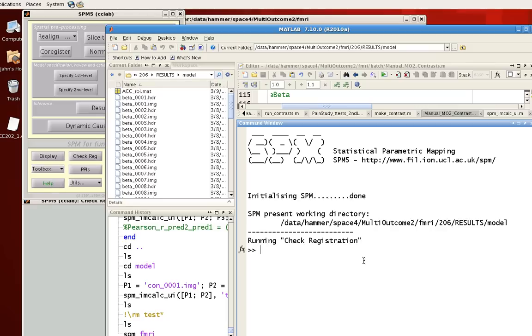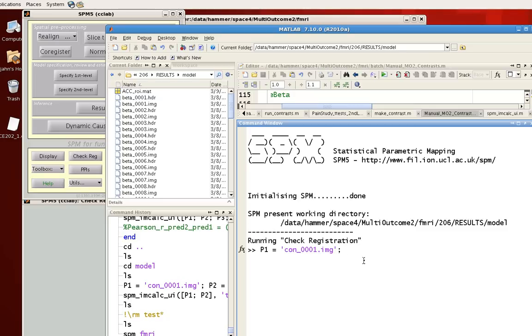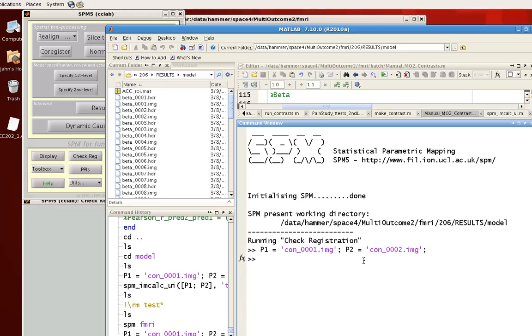So first thing it's going to need is to assign some names to our different images. I'm going to assign a variable P1. I'm going to say that that's CON0001, as you saw in the display earlier. And P2 is going to be CON0002.